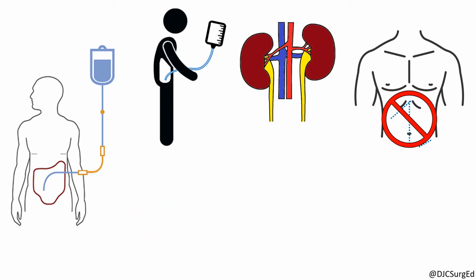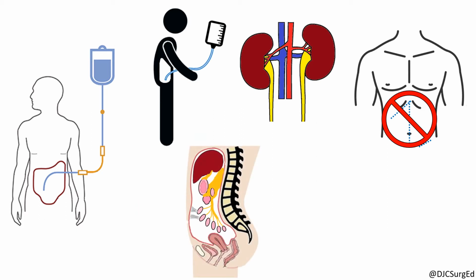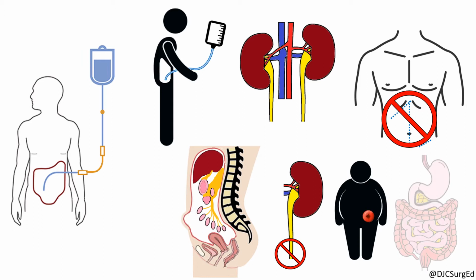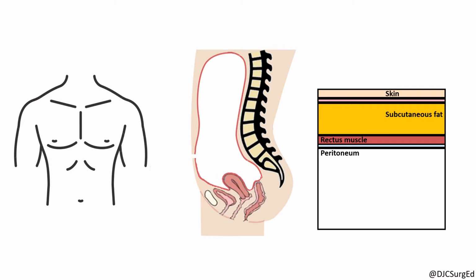Potential barriers could include peritoneal scarring and adhesions, anuria, large patient size, ostomies, large abdominal wall hernias, and acute inflammatory processes. Peritoneal dialysis catheters can be placed laparoscopically when feasible.